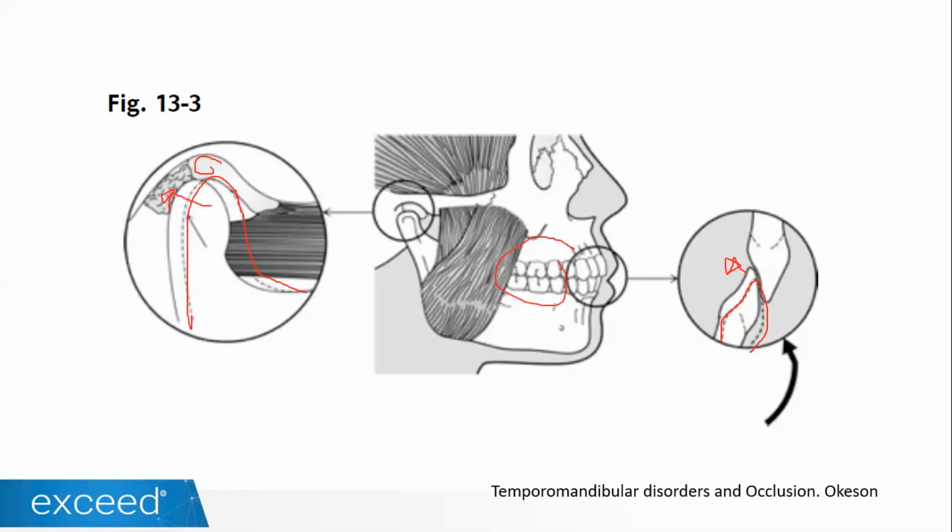And when this happens, then we have those temporomandibular joint disorders. Well, this is just one of the many that we can have. So in this patient, sometimes we go and we put an aligner. And well, first of all, for you to know, there are several therapies. How I like to solve this is, first, I like to use an appliance that is going to reposition the mandible anteriorly. I use that every night for normally around 8-12 weeks, sometimes even longer.